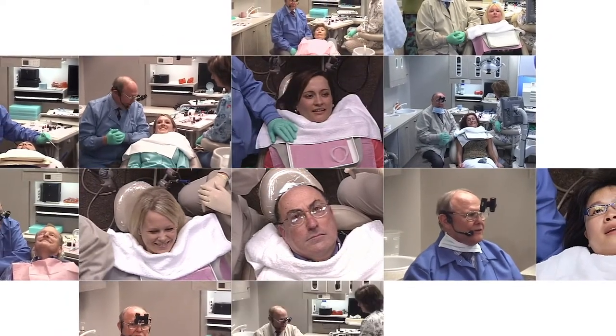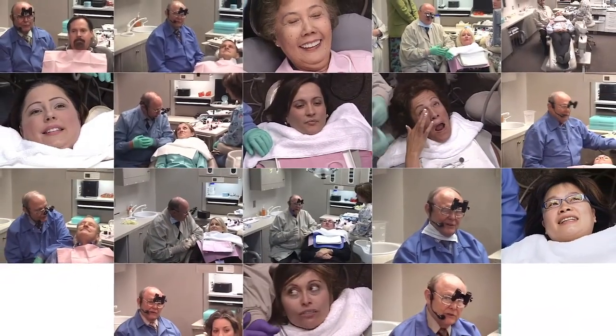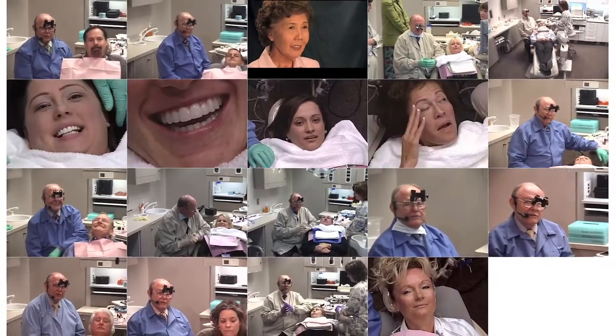Boston, Kansas City, San Francisco, Montreal, Munich, Germany, London, and Santa Maria, California. Now we're going to place lumineers on our patient today.